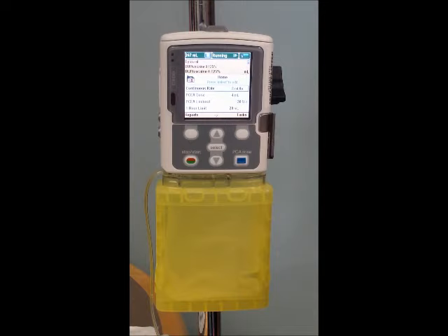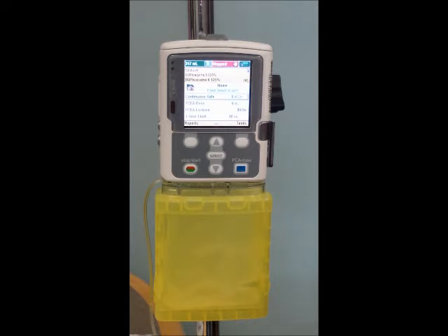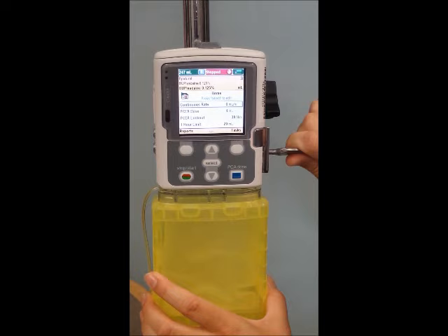To change the cassette, you're first going to want to hit the stop/start button. Confirm that yes, you're stopping the pump. You'll see the red stop sign, and you'll also get an indication at the top to tell you that the pump has truly been stopped. Insert the key to the side and turn a quarter turn toward you. Lower the lever and this will pop off the cassette.